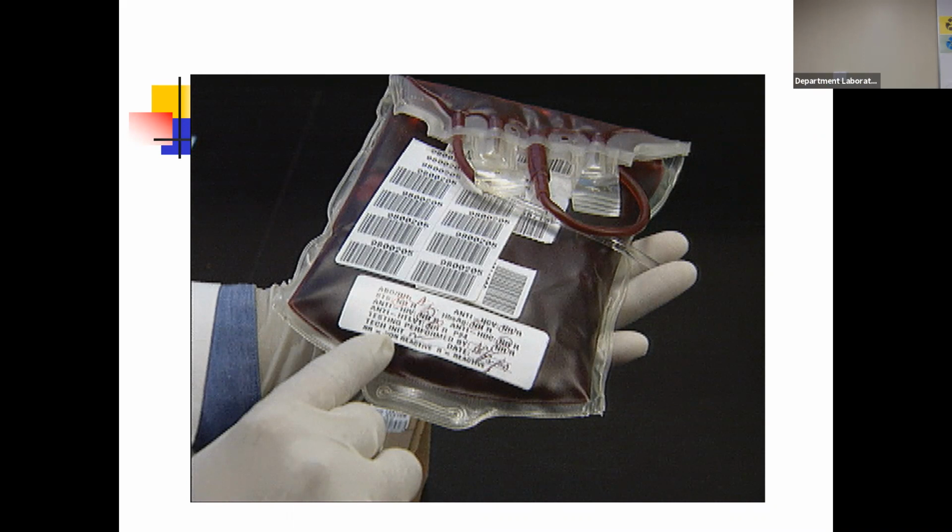And then also, this is your patient identification. This is your transfusion sticker that has all of your patient information on there. They put it on the back side to notate that this unit is going to this patient, right? And then once this unit gets to the nursing floor, the nursing staff must verify this information as well. Okay?